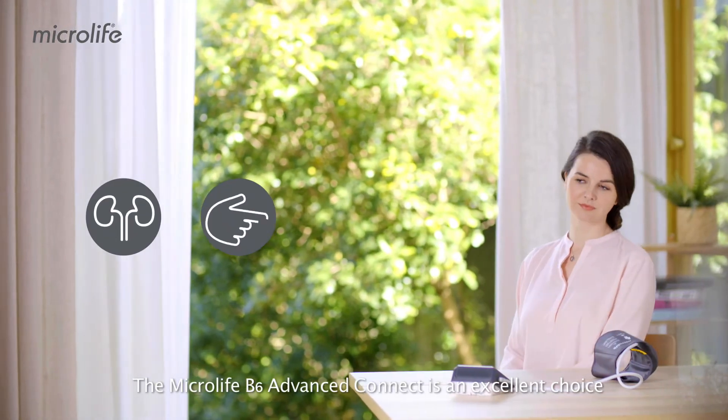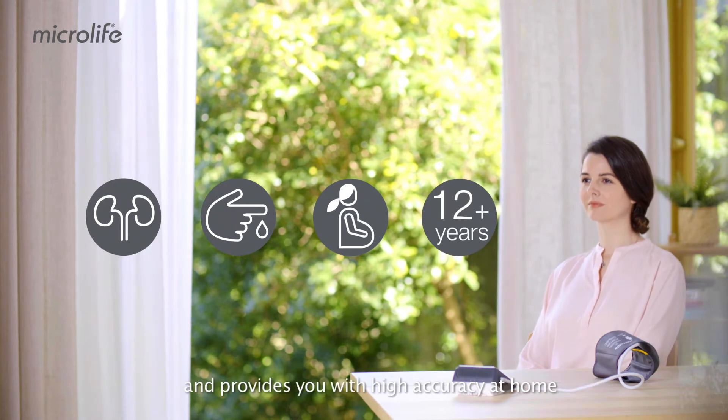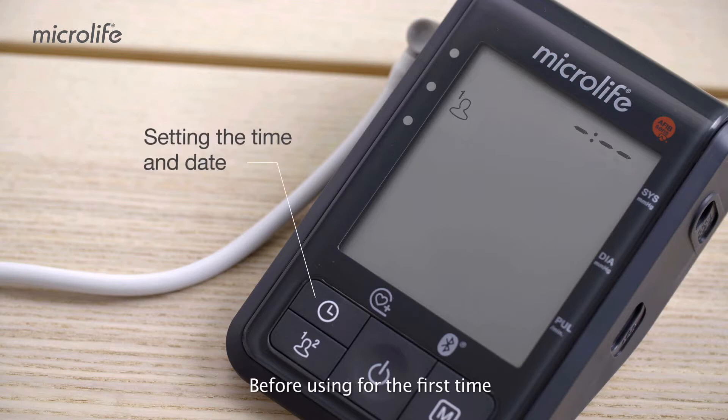The Microlife B6 Advanced Connect is an excellent choice and provides you with high accuracy at home, whatever your health condition. Before using it for the first time, we recommend that you set the time and date, enabling you to retrace your readings later.